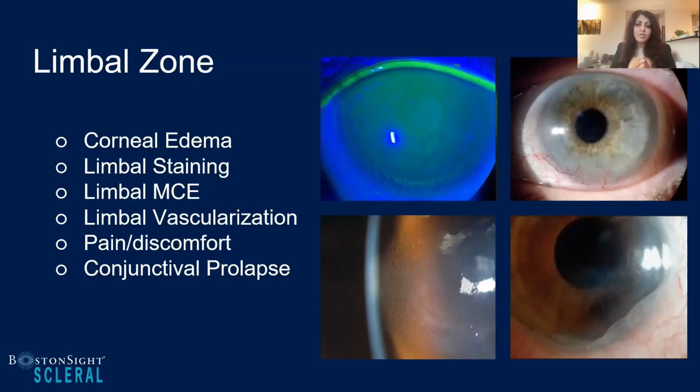and negative pressure can create edema. It can create neovascularization at the limbus there, like you're seeing in that photo. It can also cause that conj to come underneath the lens and be pulled up underneath the lens. That's what we call conj prolapse. Whenever you see these things, you have to be thinking about the limbus, and our strategy here is to make sure you reduce the amount of limbal clearance that you have, again, aiming for that 50 to 60 microns and making sure you're not touching it at all, because that's the area where all the stem cells are, and you don't want to make any damage to that region there.